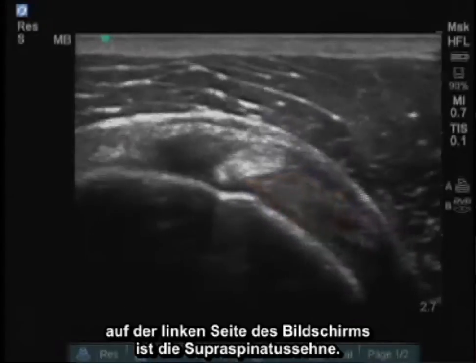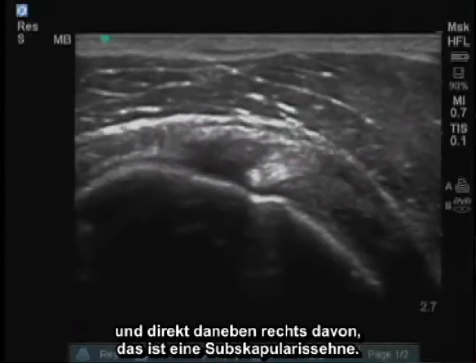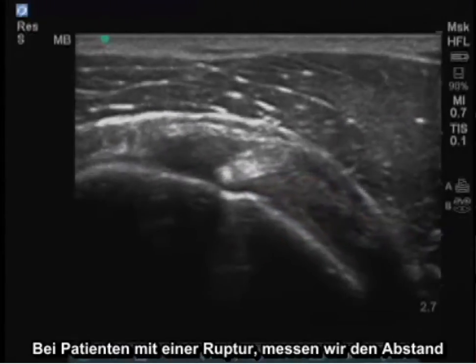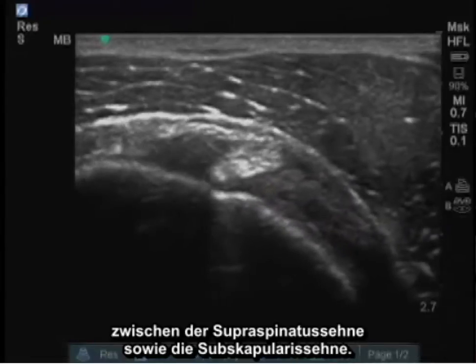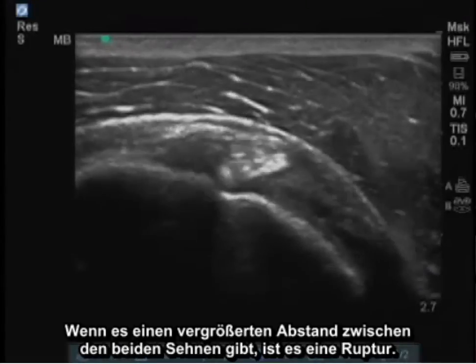On the left of the screen is the supraspinatus tendon. Next, there's the bicep tendon, which is the white circular structure seen. And just adjacent on the right to that is the subscapularis tendon. In patients with tears, we measure the interval between the supraspinatus tendon as well as the subscapularis tendon — if there's increased distance between the two, it's suggestive of a tear.